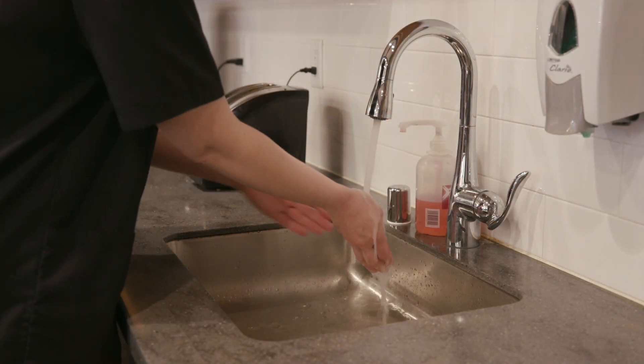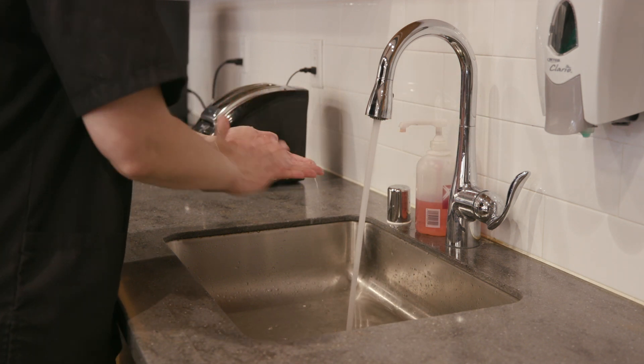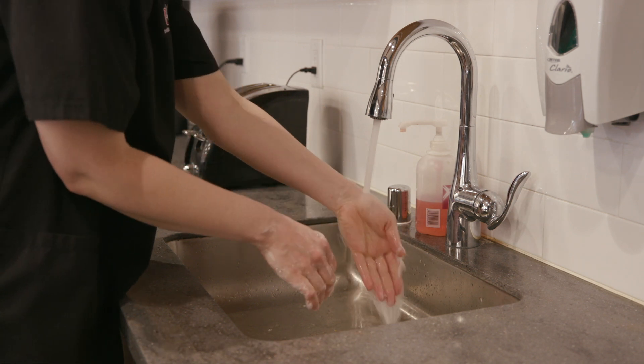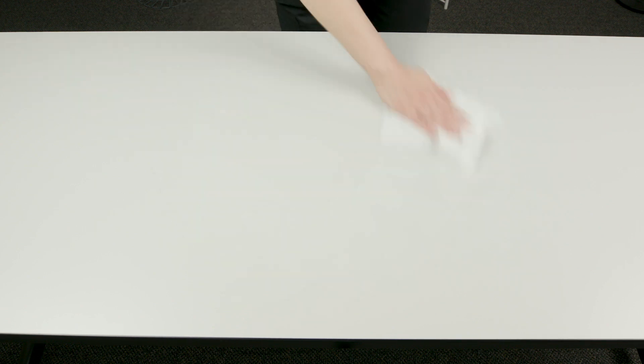When it's time to give the infusion or change the bag, clean your hands with soap and water or a disinfecting wipe. Clean your work surface with soap and water or a disinfecting wipe. Cover your work surface with a paper drape or clean towel.